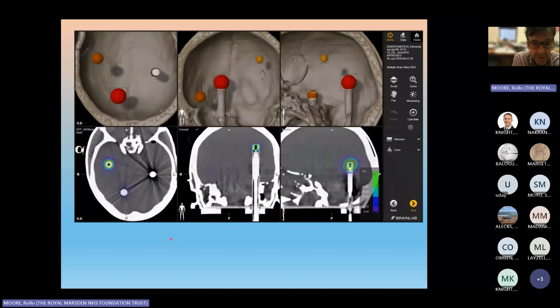But for those not familiar with CT, it represents a sectional view, and what wouldn't be in the patient is our detectors here, which are illustrated by these white areas and by the spheres on the top of these detectors, representationally rendered in the computer for us. And at this stage, I'm going to try and show you a moving image, which is in fact a simulation.